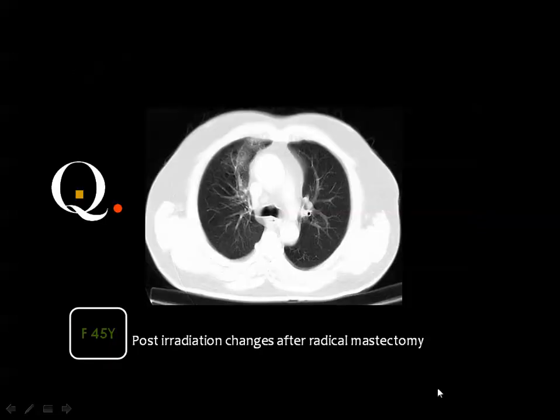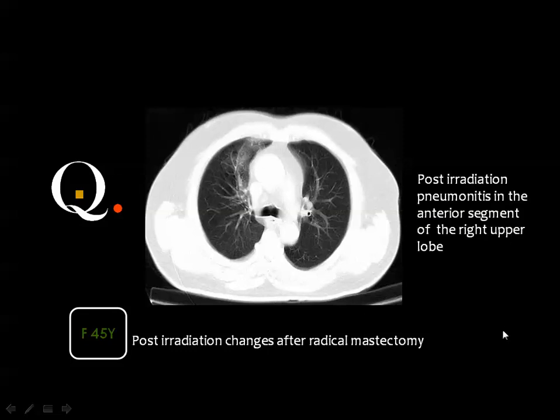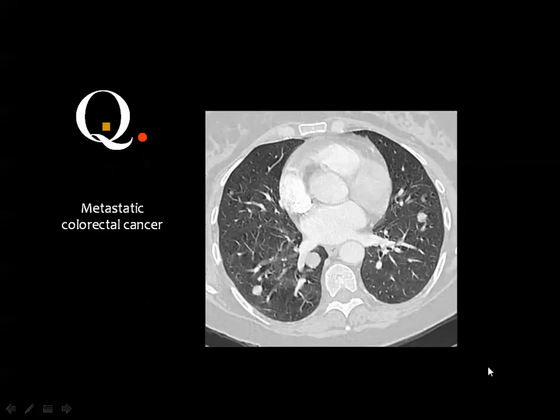Case example: a breast cancer patient treated with radical mastectomy and irradiation who developed post-irradiation scarring. Looking at the tracheal bifurcation — the trachea has divided, so anteriorly is upper lobe and posteriorly is lower lobe. Drawing the dividing lines, the affected area is the anterior segment. This is irradiation pneumonitis in the anterior segment of the right upper lobe.